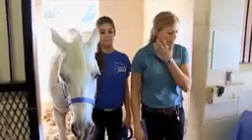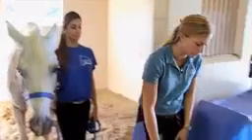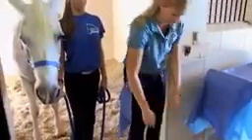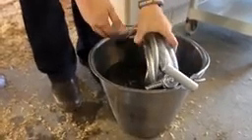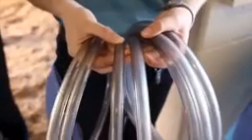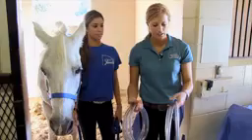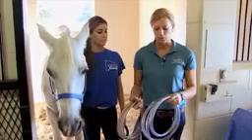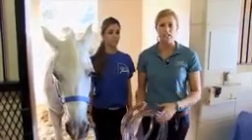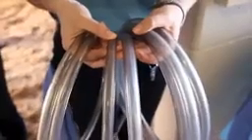So we have a couple of different types and sizes of tubes. I keep them in my bucket here in the water. When they're just sitting in the water, it just kind of softens them up a little bit and makes it a little easier to pass. Right here I have two different sizes. There's a medium tube here and then a large tube here. You can tell the difference of the size here. I typically, if it's the first time I'm seeing the horse and the horse is colicking, I'll use the large tube because it's easier just to lavage anything out of their stomach. For demonstration purposes today, I'm just going to use the medium tube.